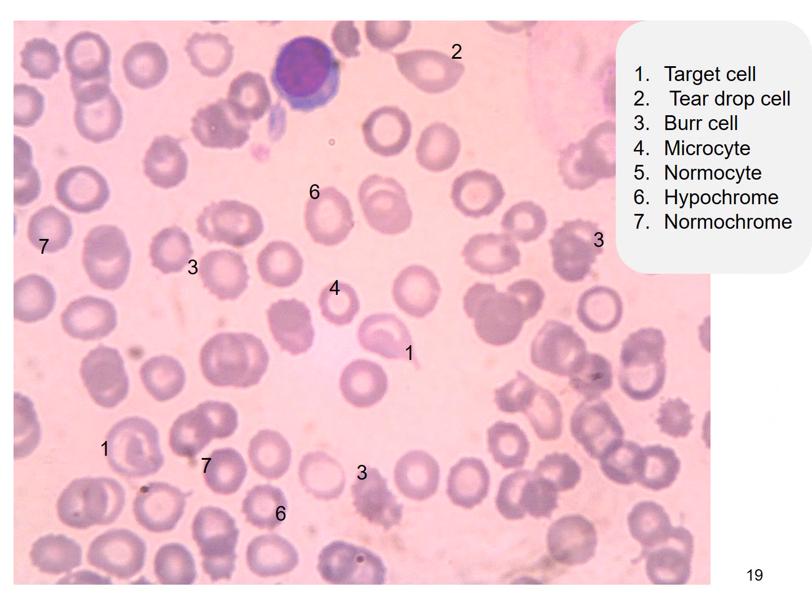In this picture, we can see number one is the target cell, number two is the teardrop cell, number three is a burr cell, number four is a microcyte, number five is a normocyte, number six is a hypochromic erythrocyte, and number seven is a normochromic erythrocyte.